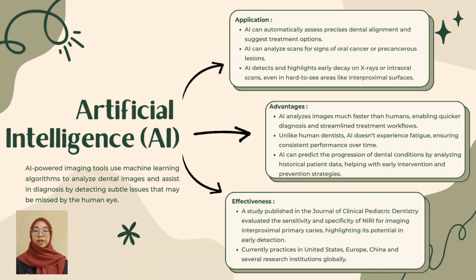So now, let's have a look at the latest technology in this modality. First is actually artificial intelligence. AI has transformed dental radiography by introducing machine learning algorithms capable of analyzing complex radiographic data with precision. Beyond diagnostics, AI supports early detection of oral cancer, precancerous lesions, and also subtle structural anomalies that may escape human observation. By providing consistent, fatigue-free analysis and also integrating with treatment simulations for implants or orthodontics, AI has become crucial in advanced dental care worldwide, especially in regions like the United States and also Europe.